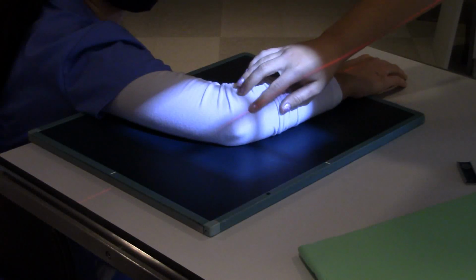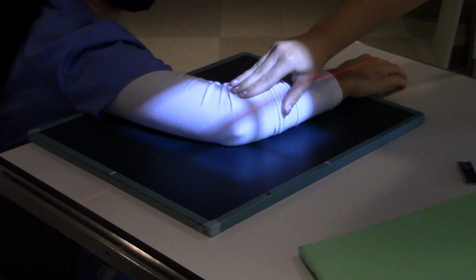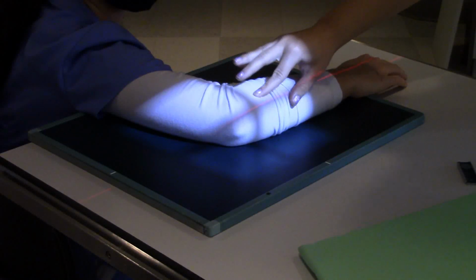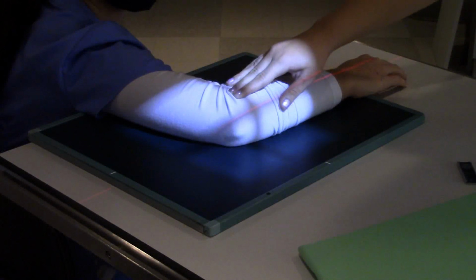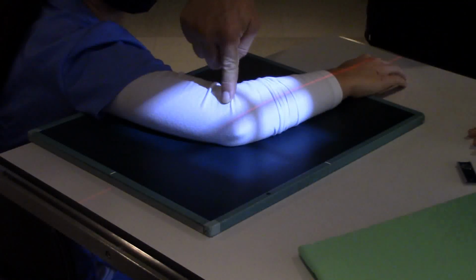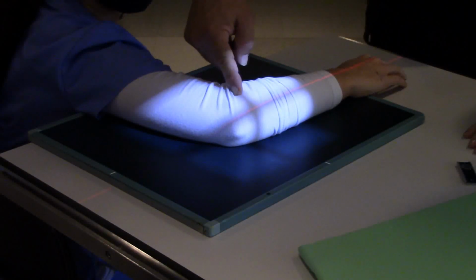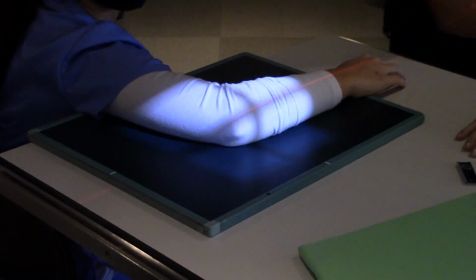When you say distal, do you mean going down like this? No, towards her hand. Oh. So should it be over here? Can you feel her? I think this is her condyle. Can you feel her epicondyles? Right there it is. It's that giant bone sticking out. Okay, so right there. Yeah, you're approximately correct. That's so good. Up a lot more too.